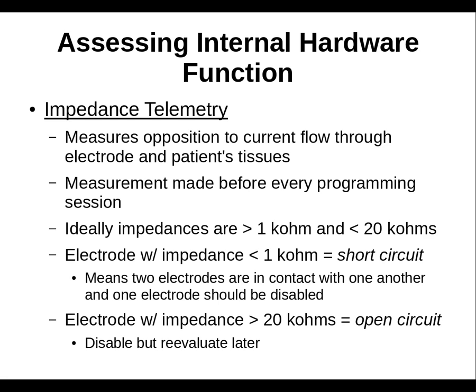Just a couple other issues related to the electrode impedance and the electrodes in general. Facial stimulation is a very common side effect, really perception of some kind of non-auditory signals. Could be tactile perception. So facial stimulation or tactile perception in general is a common side effect of electrode stimulation.